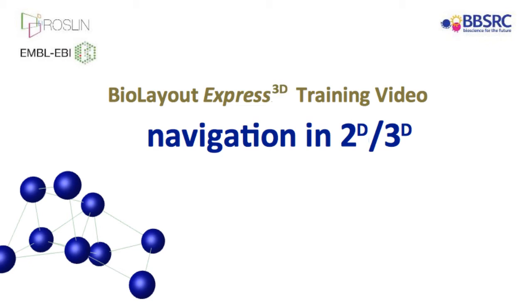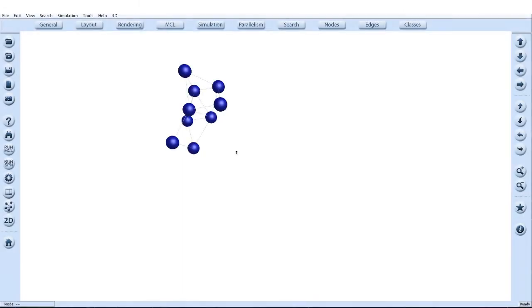Welcome to BioLayout Express 3D training video. Here we will cover the navigation of networks in two and three dimensional space. Let's start by looking at a simple graph displayed in BioLayout 3D environment.